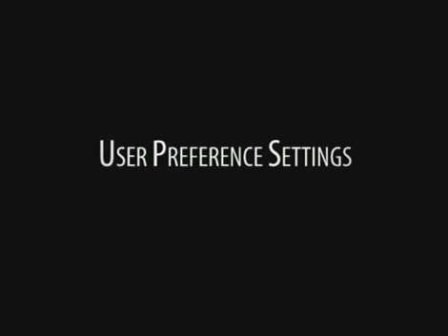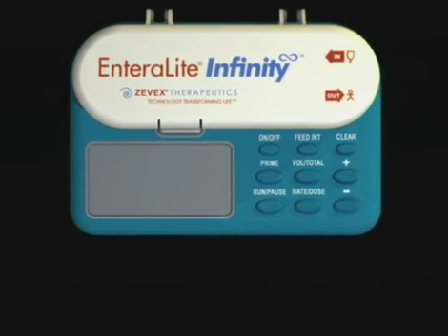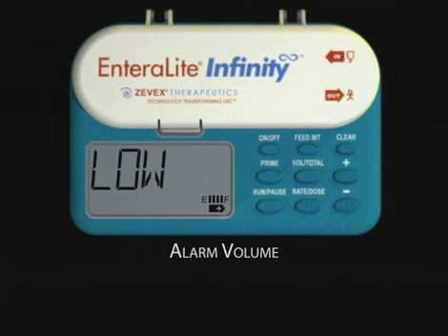There are 4 user preference settings on the EnteraLite Infinity. To adjust the user preference settings, press and hold the on-off and plus keys at the same time for 1.5 seconds. The pump will beep and then display the words beep high or beep low. To change the volume of the alarm, press the plus or minus key to the desired setting.